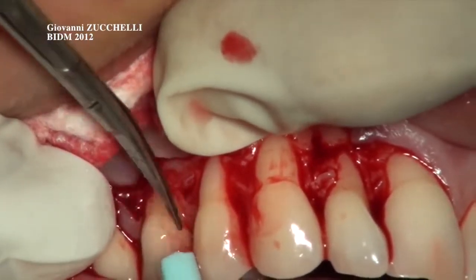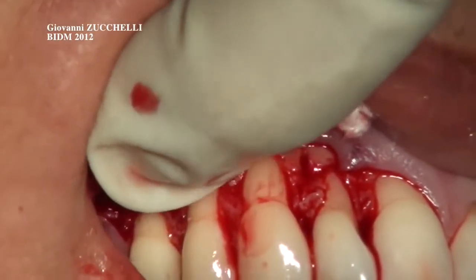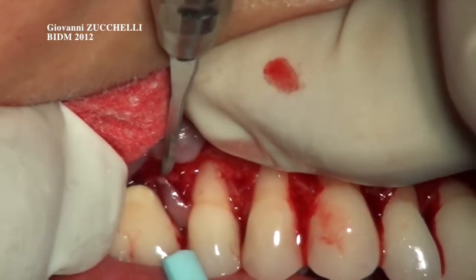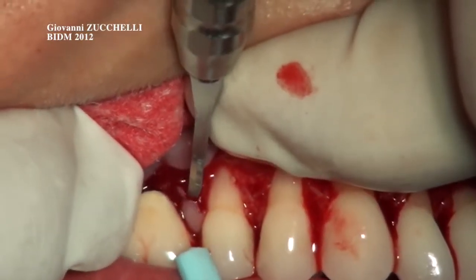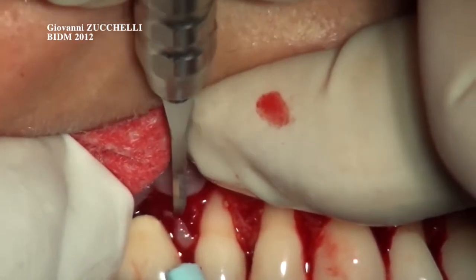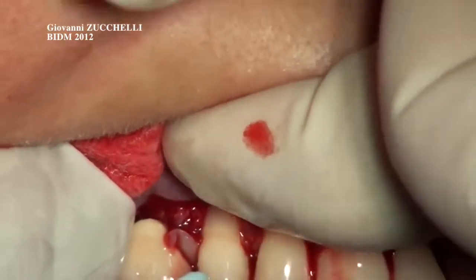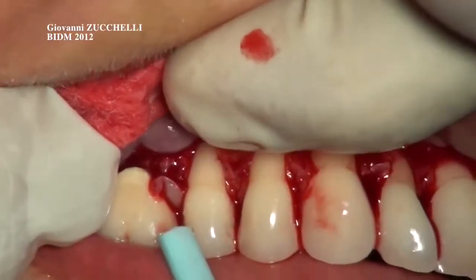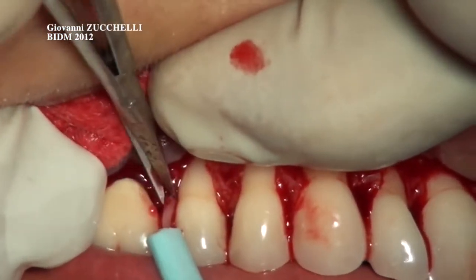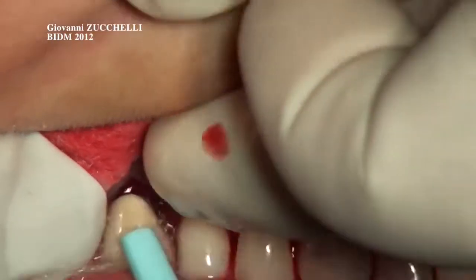Okay, it's even too easy. It's more difficult to explain than to do it. Follow the incision line. Now the epithelium is detached, so it's possible to follow the same incision line and complete desepithelialization.